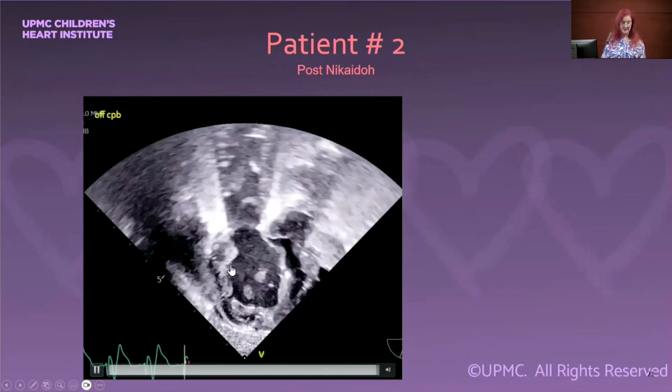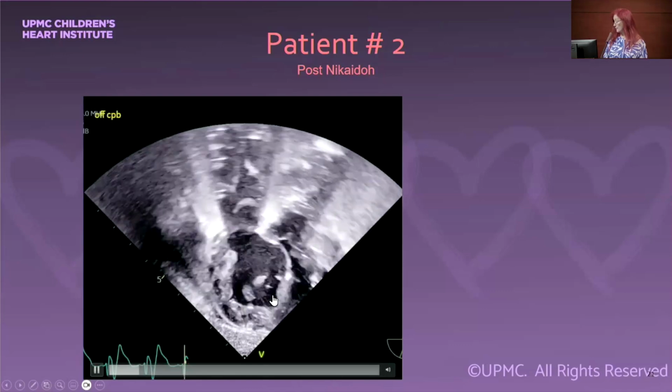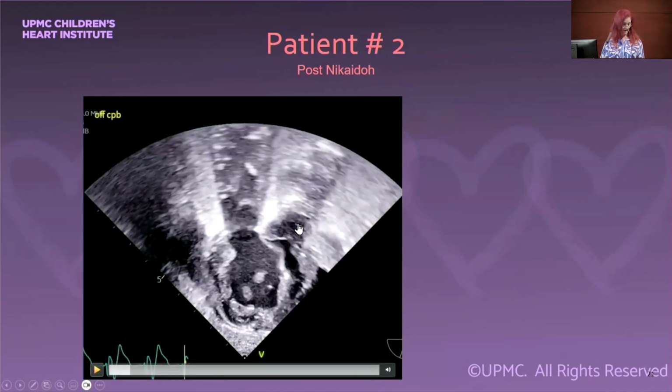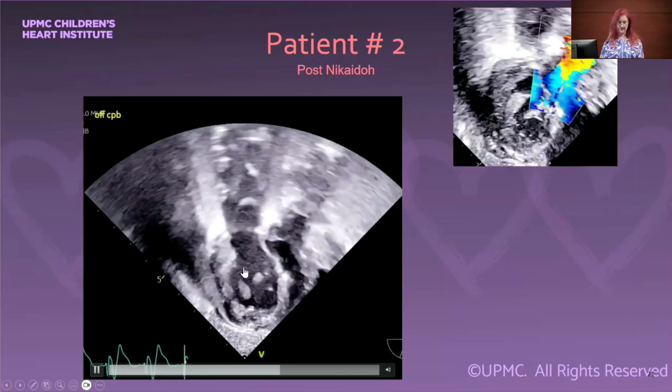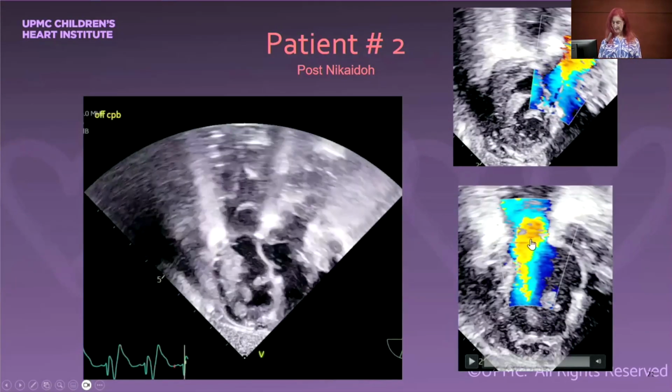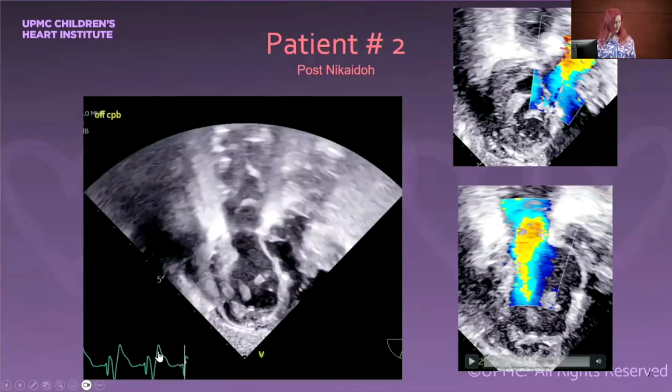And you can also see that this RV cavity has been well preserved compared to that other patient that I showed. And I did put some color in. LV to aorta and RV to PA were widely patent.